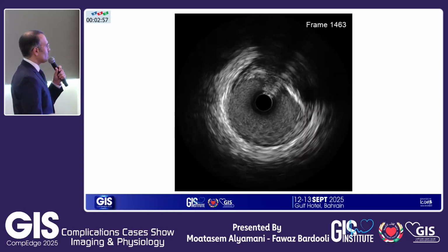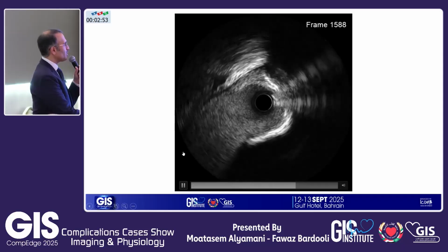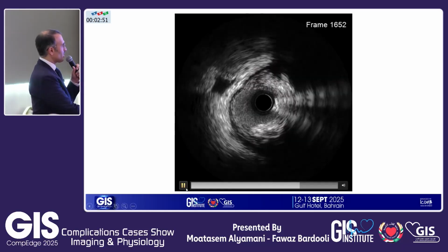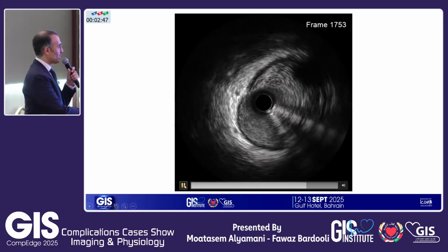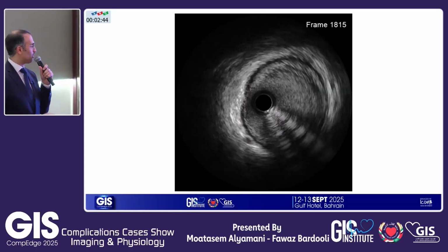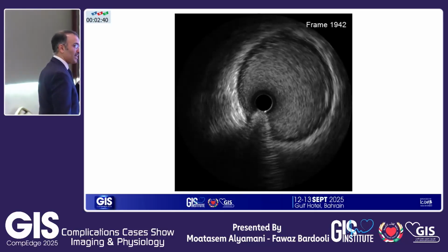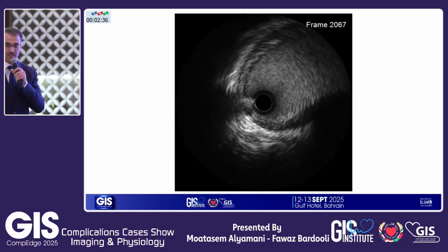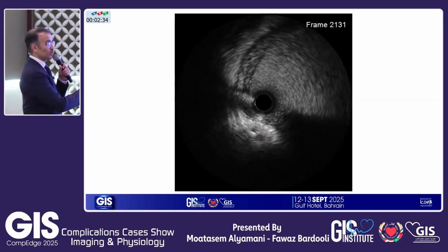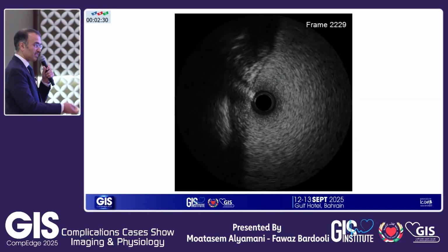Yeah, this is just run slowly. So you remember that I told you there is an area in the proximal LAD which seems to be fine. That was the area, and you saw that this is the distal left main. Now let it run, and you will see what the proximal left main looks like. Look how big it is. So if I go by area-wise, there is no doubt that the distal left main, as you correctly said, is significant, and the plaque burden is very high. There is no doubt at all that the mid-LAD bifurcation is significant.